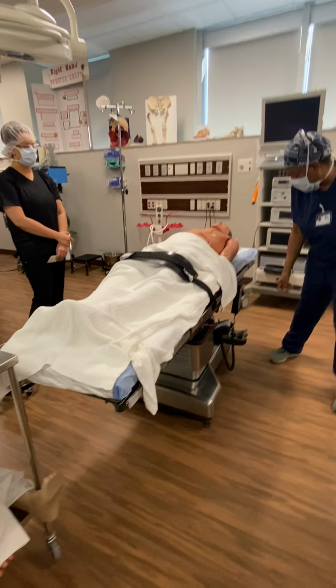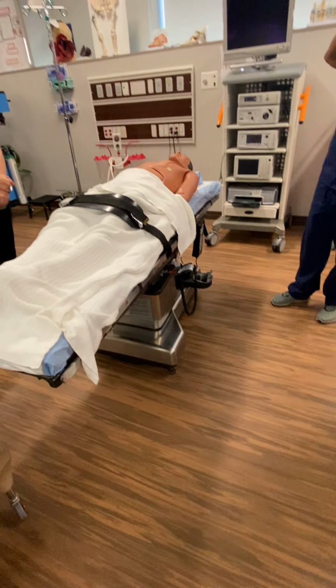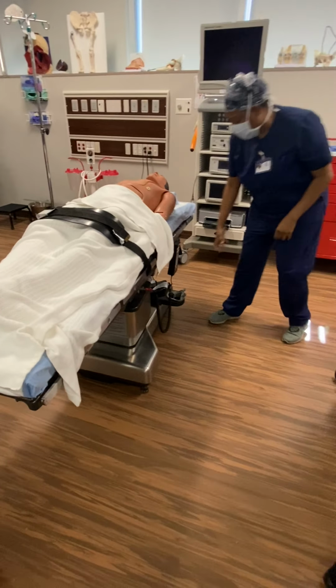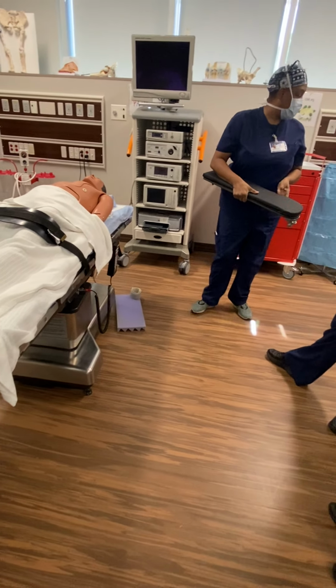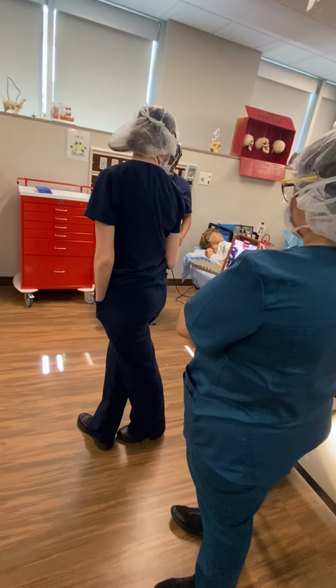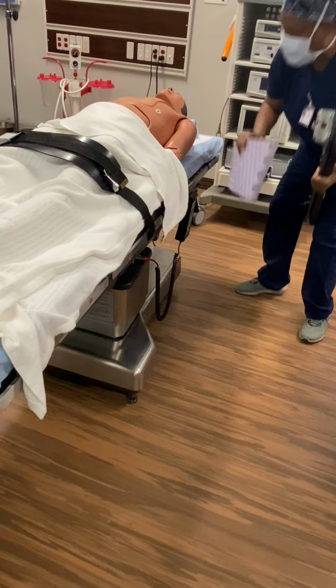Next, let me show you what I want to do first. If you're scrubbed in and your nurse says, hey, I need your help, we're going over the arm boards. Sometimes the padding may be thicker. You don't want it too tight and cut off their circulation. See how thick this pad is versus this one? Always make sure there's something between them and the belt.